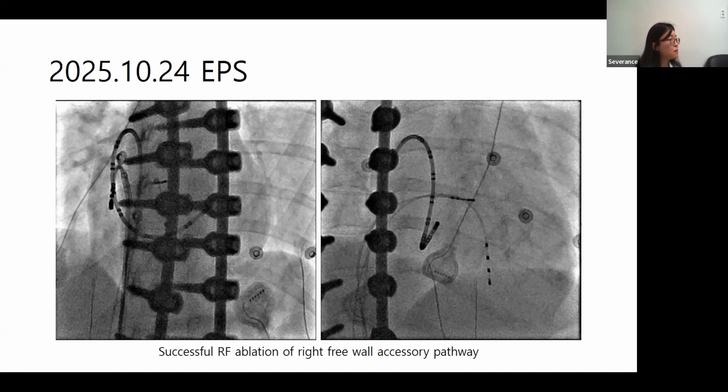I have two questions. The first is from the surface ECG. You mentioned that the QRS duration can help tell whether it is closer to the His or further from the His. Is there a cutoff value? No, because I already told you that it depends on the degree of the feature.